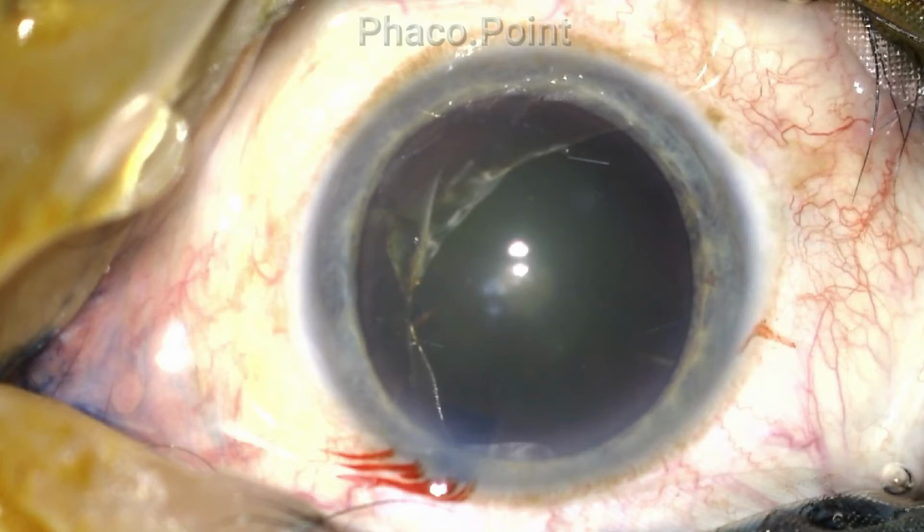I'm going to introduce my instruments from the right side port incision using my non-dominant right hand at 10 o'clock, which is fairly far away from the site of the tear. Let's now see how this case was managed.